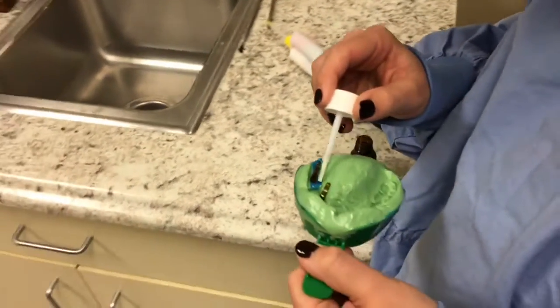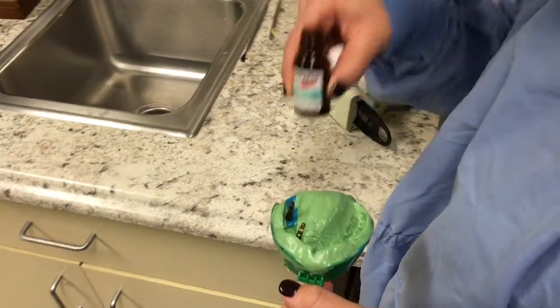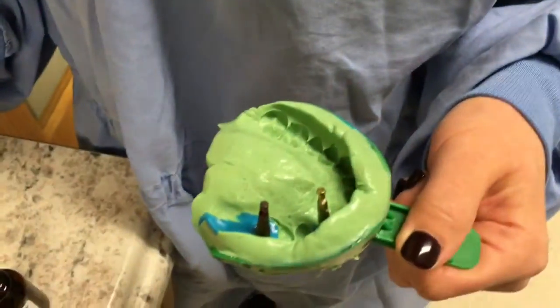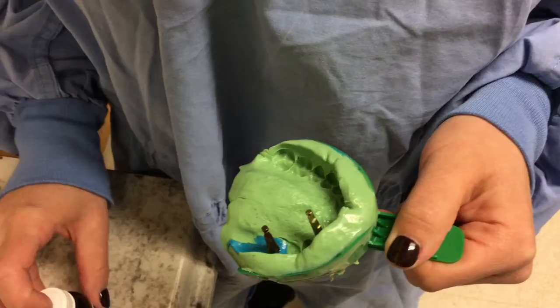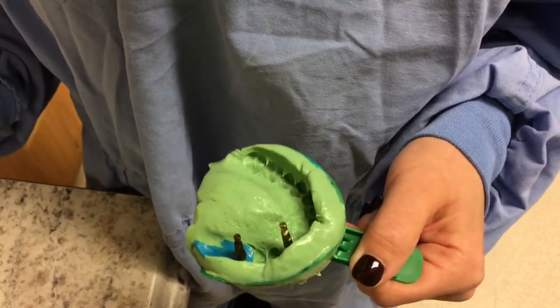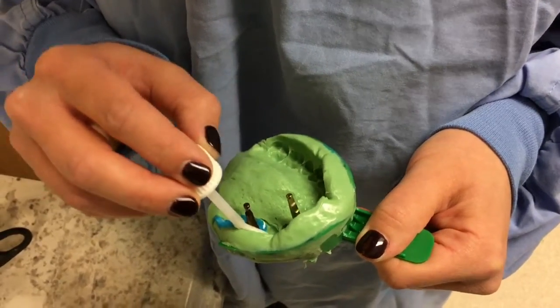We're painting on the separator so the two materials don't stick to each other. This is how you make a GI mask for your model.